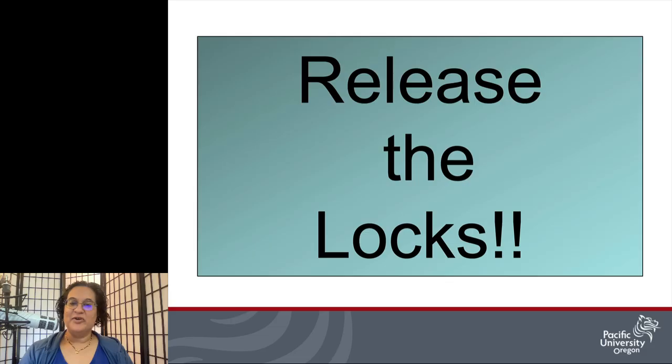I'd like to remind everyone to make sure when you move the equipment that you're not forcing it, that you make sure that the lever or the lock has been released, and you don't need to turn it a lot, just a half turn. Make sure that that equipment moves comfortably and with ease when you are adjusting things. So when you pull the phoropter in front of the patient and when you move it back away out of the way, make sure that you are releasing that handle, that lock, to make it move smoothly.